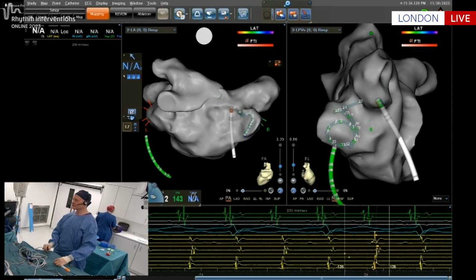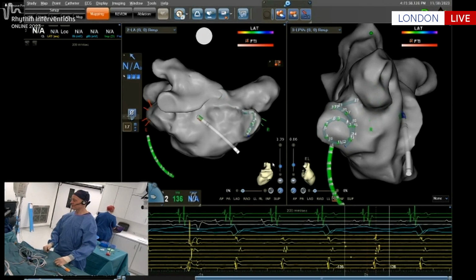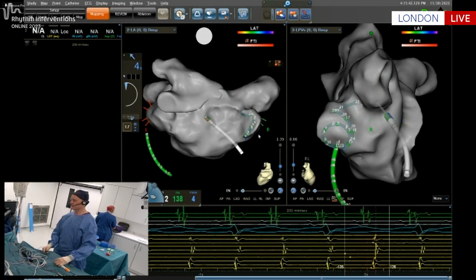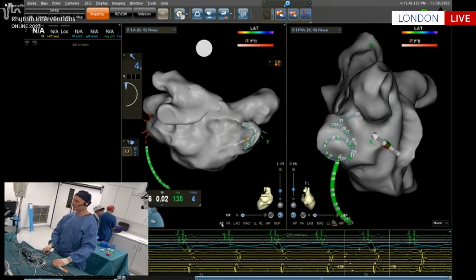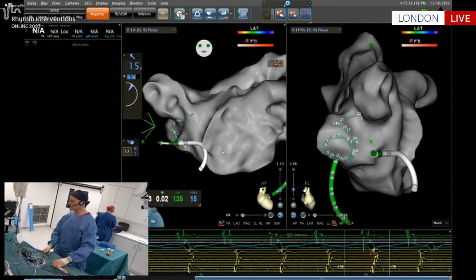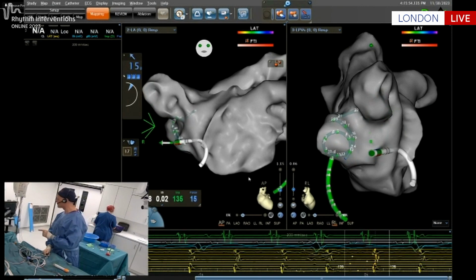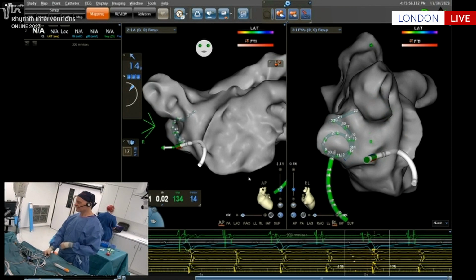Can I get you to zero the force, please, guys? Well, just zero the force on the map, and then let's put the mapping catheter near there. Can I have AP on the left-hand view? And if you can put the mapping signal, mapping's on 16 on the BARD.